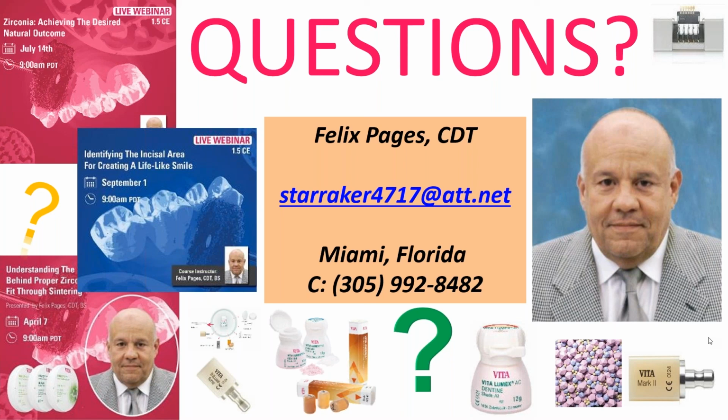So they did it out of the same color zirconia. It was like an A2, A3 shade. And they took the pinks that they have to try to paint the tissue. And I'm like, what in the world is that? It just didn't look right because the zirconia is too opaque.